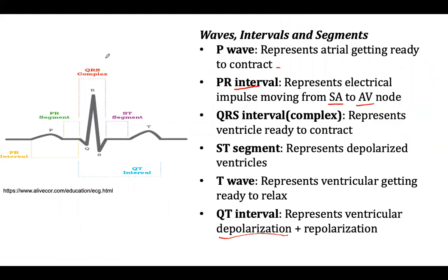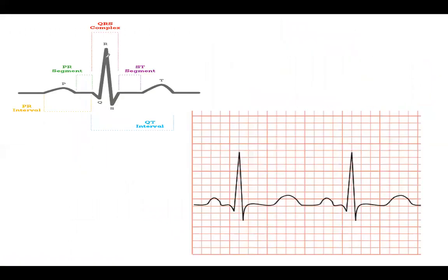Now, we're going to get started on assessing our ECG, but I'm going to start with looking at a picture and how you actually label each of the components. This is good practice for you to identify components as we go through the 5 cardinal rules. So right here, this is a structure that I have.